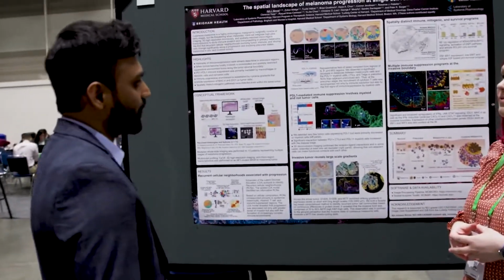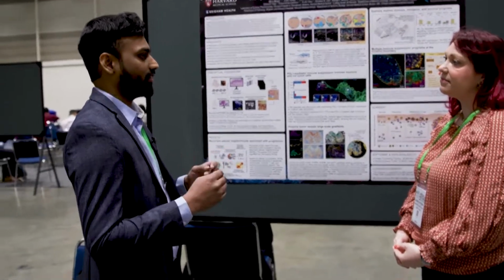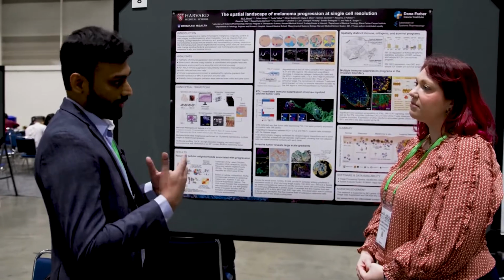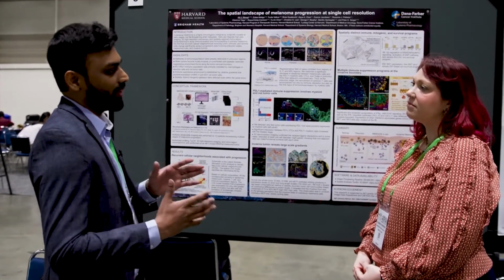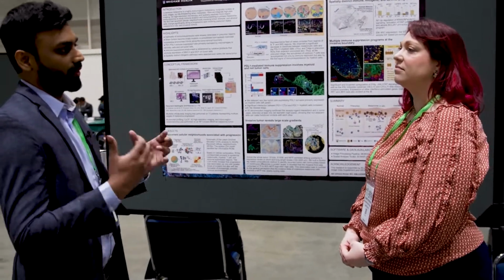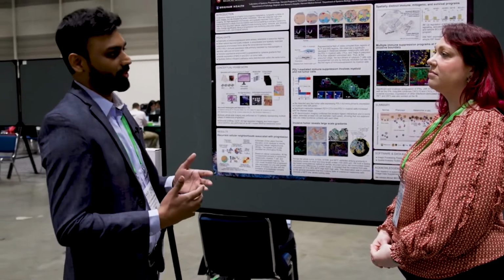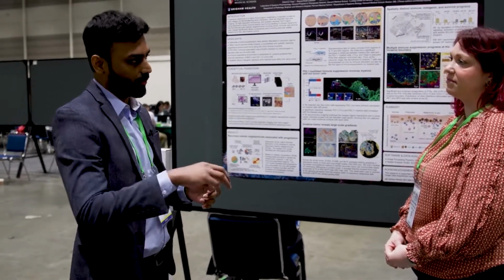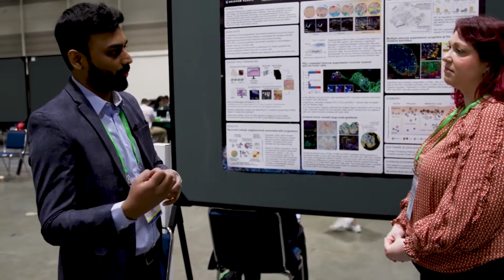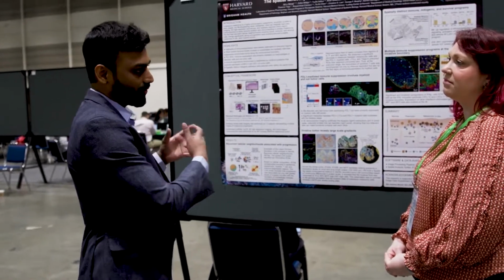So it's a twofold explanation. With the spatial data, we can infer whether a particular cell type is interacting with another cell type across the whole image, and then we can narrow down on regions where we find these interactions. And if we want to understand the biology, that's when GeoMx comes into play. We identify those ROIs and do a whole transcriptome analysis, or WTA, and identify what pathways are different in these regions compared to other regions where they do not interact.